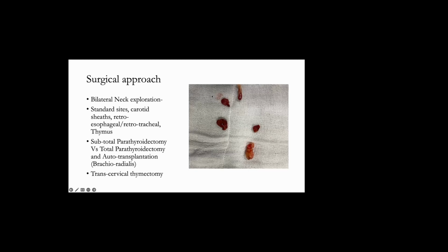So I did 3 gland excision in these patients. Here, one has to decide whether you want to do a subtotal versus total with autotransplantation, because if the autotransplanted tissue doesn't survive, then the patient will end up with aparathyroidism, which is worse than hyperparathyroidism. So one has to be really careful in deciding the extent of surgery.